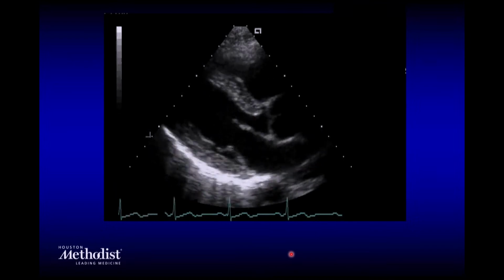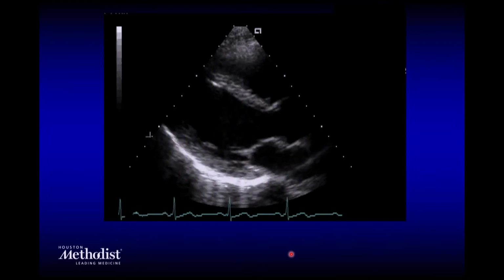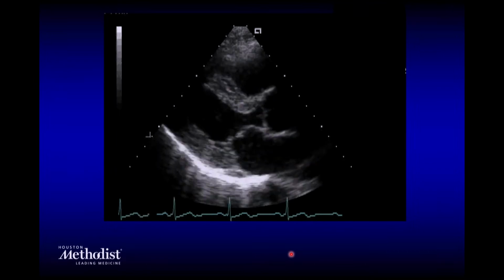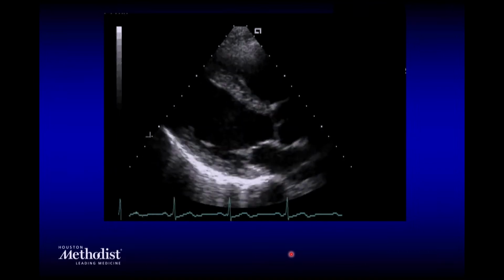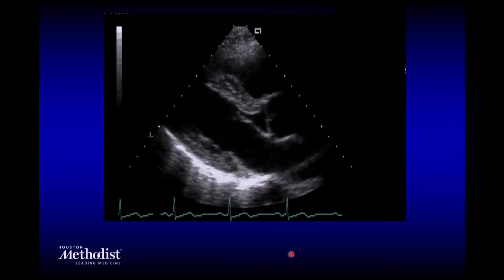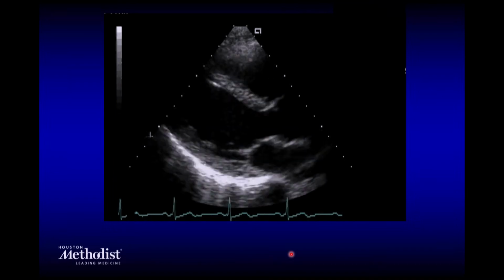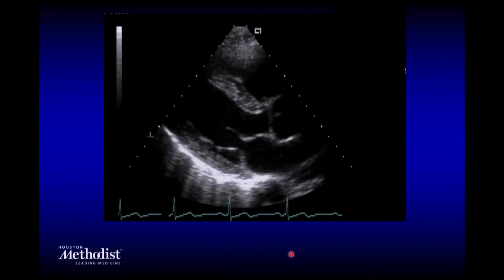Most of it is reflected back, as opposed to abdominal or carotid imaging, where the transducers are linear. You're not a sector, you're just a rectangular or symmetrical box of linear lines. Why? Because I'm sending the ultrasound straight down, as opposed to here in a sector, to avoid problems of imaging through the ribs.